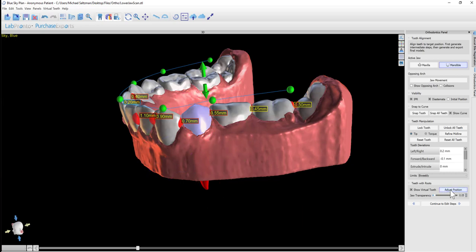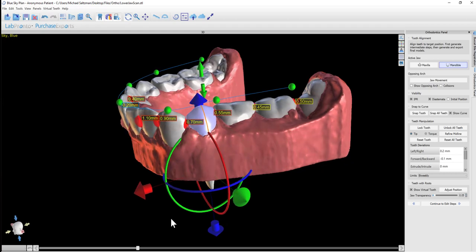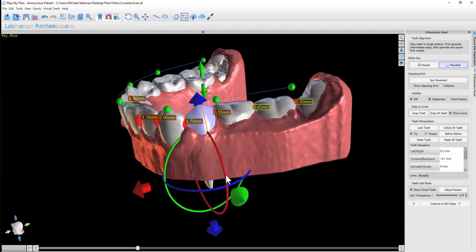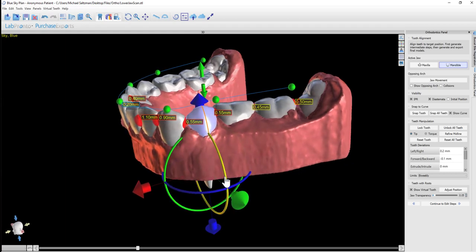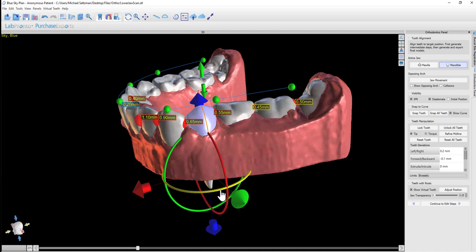Any time we pivot or move this tooth, the virtual tooth will move as well. This will give us an indication of how the teeth roots will move and adjust when we adjust the crown of the tooth.